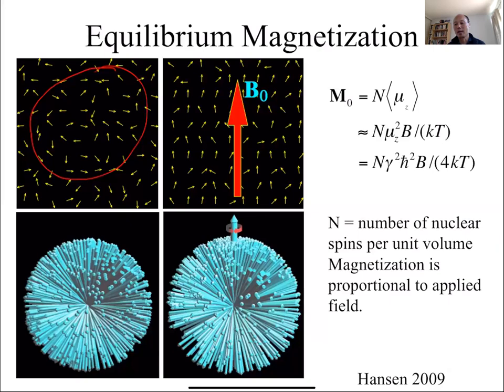And so if you assume that all these little vectors are these little magnetic moments, and you took their tails and put them all together to make a little, like a Kush ball, then because they're all pointing in different directions, they're all going to cancel out. So the net magnetization of this system here is going to be zero. Okay, so this is going to have M equal to zero.